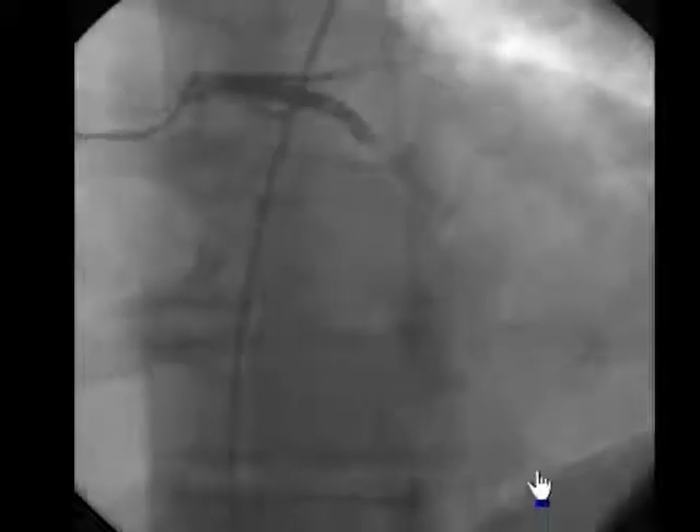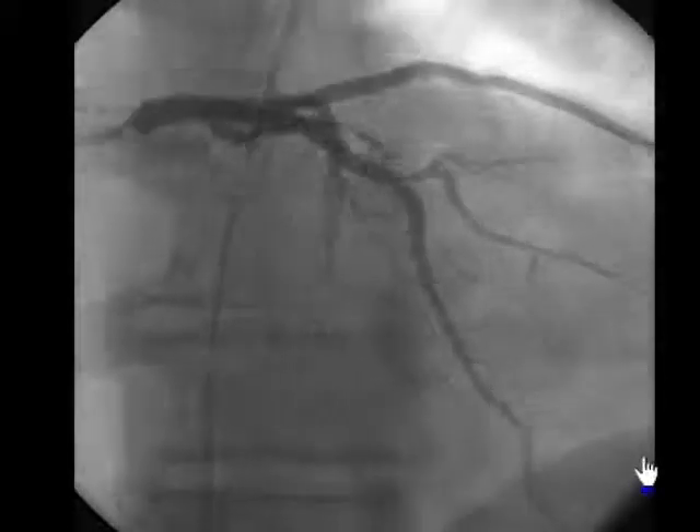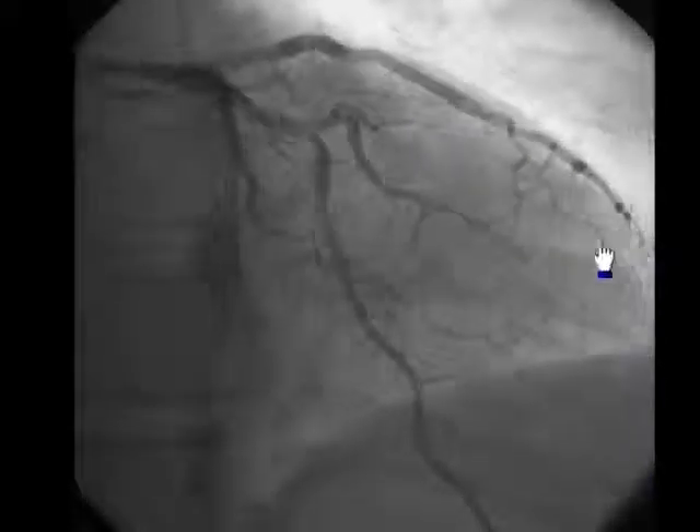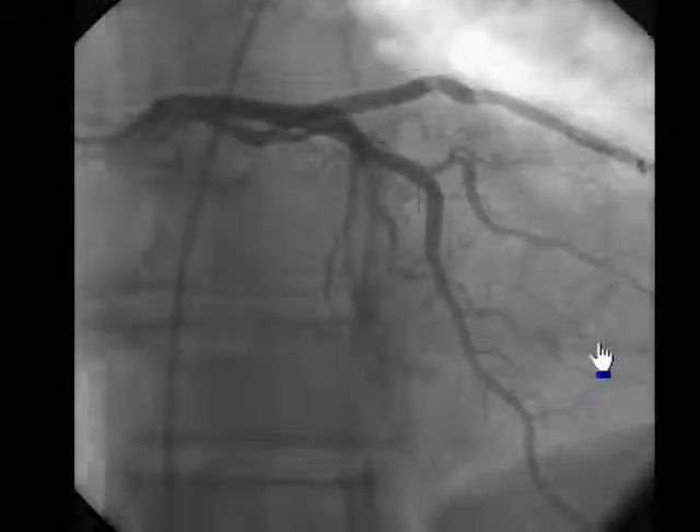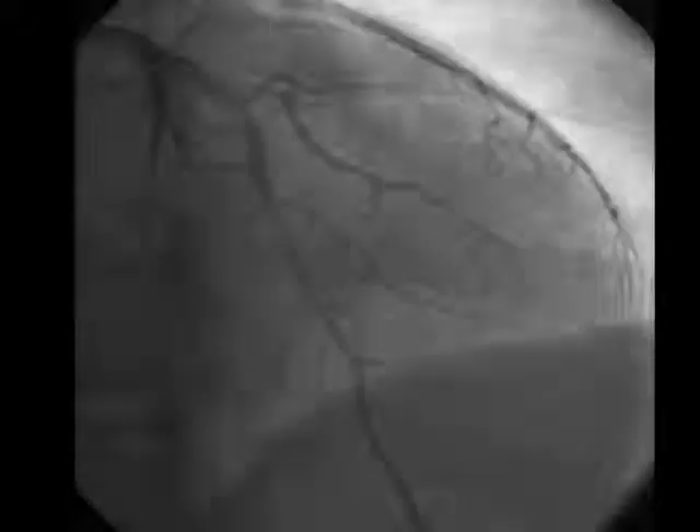Another unique characteristic of mine. So let's put this thing in motion. You'll see here's the tip of the wire, and you'll see how things illuminate and all the arteries kind of come up. And there it goes — it's being illuminated. You'll see how now it's around and all the little capillaries and everything's getting all filled up. It was very cool.